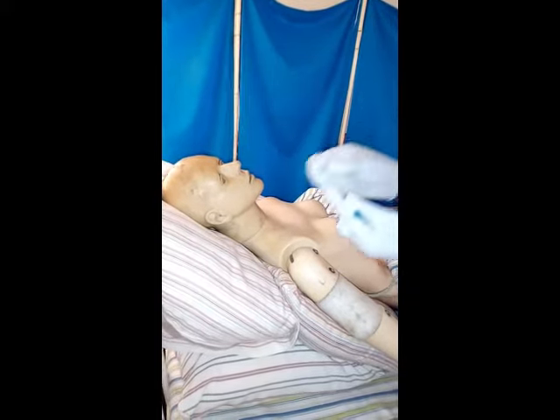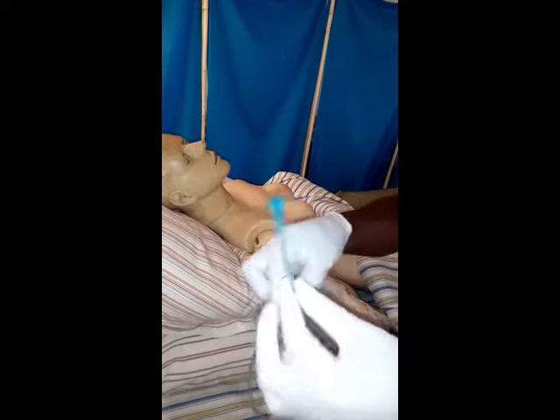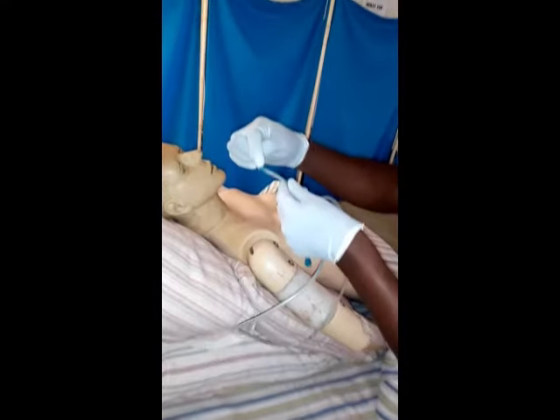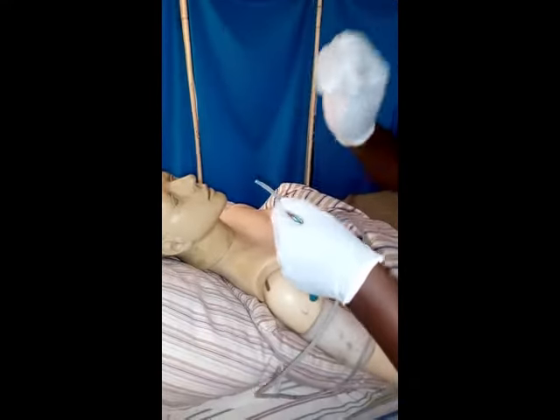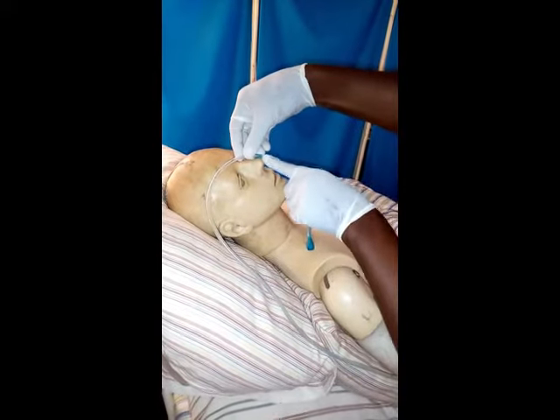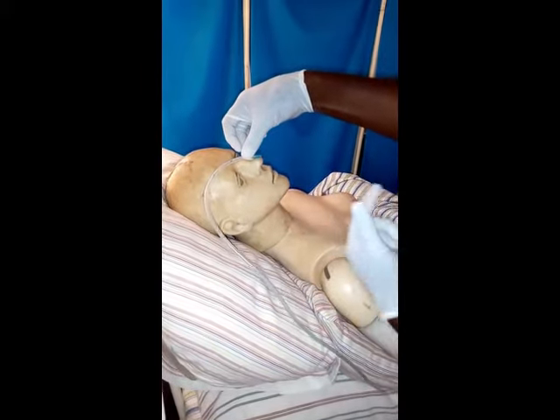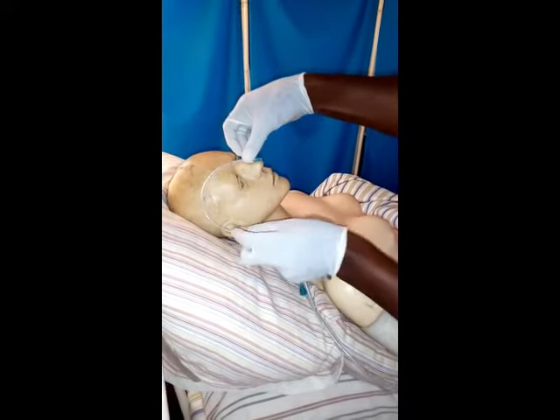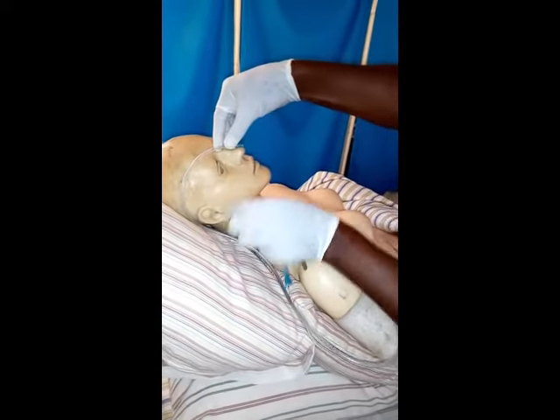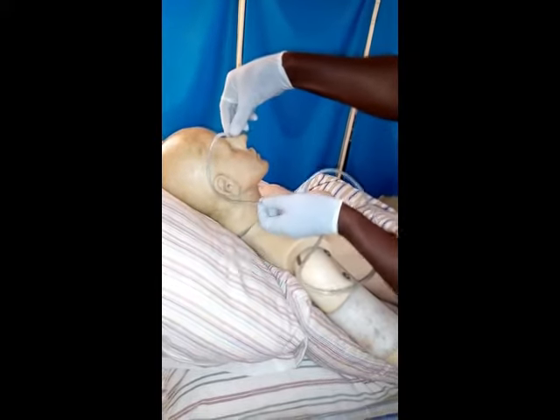So that's why you take this part here, not where the spigot is, because this part will be outside the patient's body. But then let's look at this part which will be inserted into the stomach. So that's the one that goes on the tip of the nose. It goes like that. This is critical because if you don't measure it, meaning you won't know which part will go in. So let's go. Then it goes behind the earlobe like that. I'm sure you're taking note. From the tip of the nose, then goes behind the earlobe like that.